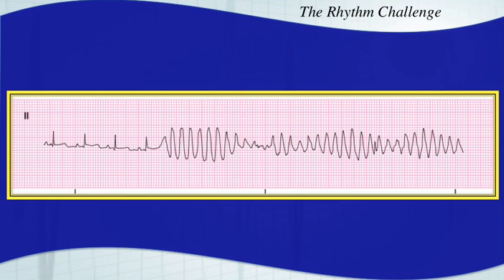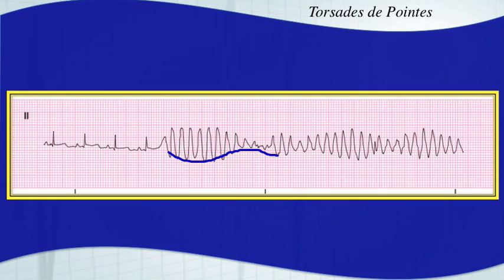You have two different types of rhythms here. You have a sinus rhythm that goes into torsades de pointes. A very clear bow tie effect, and it did happen because of an R-on-T phenomenon. Torsades.